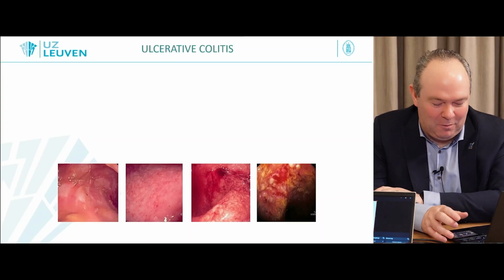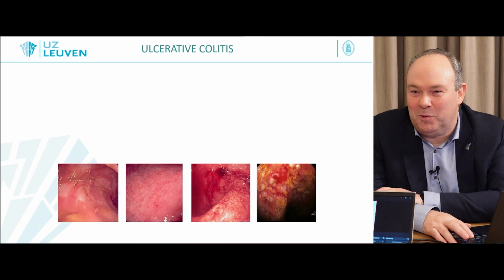Thank you, Thomas. So we have successfully brought the difficult Crohn's topic behind us. Now it's seemingly getting easier with the endoscopic classifications of ulcerative colitis. Enlighten us, please. Yes, so we'll address two, and obviously the most common one is the Mayo score.